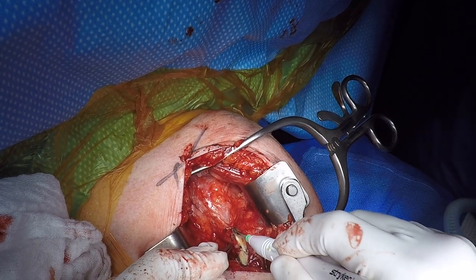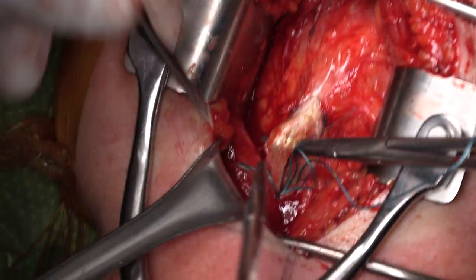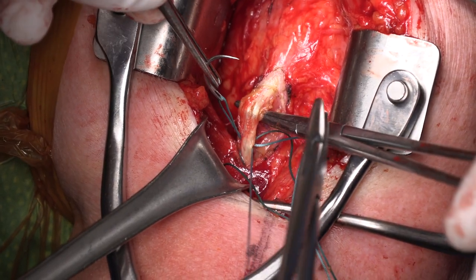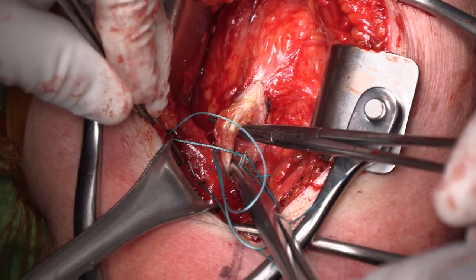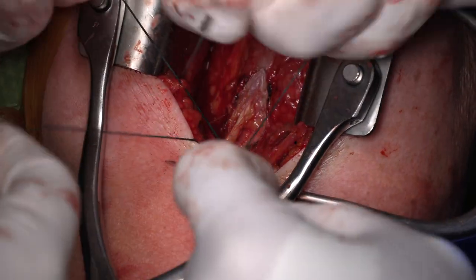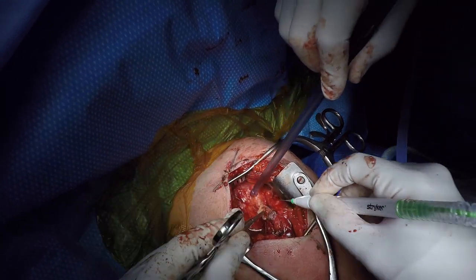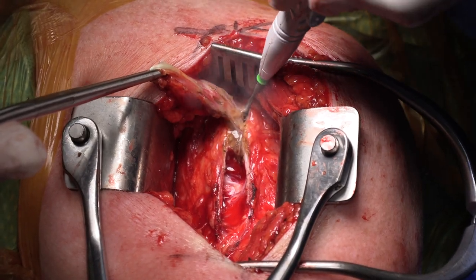The biceps tendon is palpated within the bicipital groove and exposed. Number 2 non-absorbable braided sutures are then passed through the tendon and through the soft tissue adjacent to the distal portion of the groove and to the pectoralis major tendon. The sutures are tied to securely complete the tenodesis. The biceps tendon is then divided just proximal to the tenodesis, dissected and visualized up to the rotator interval, and excised.